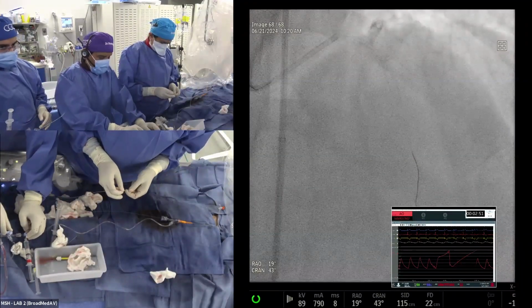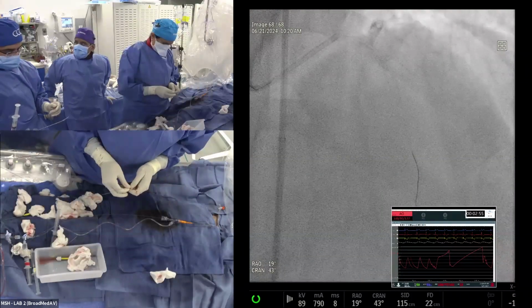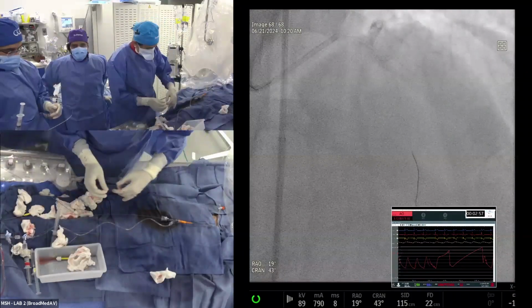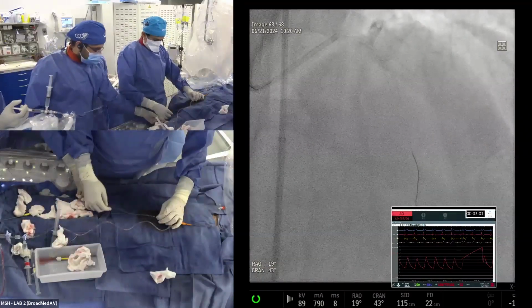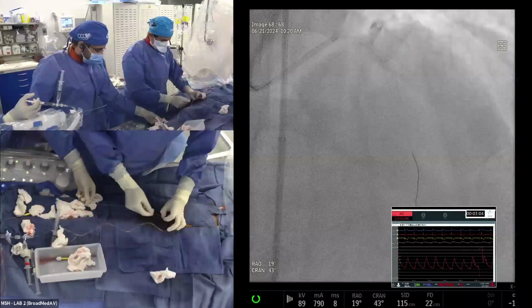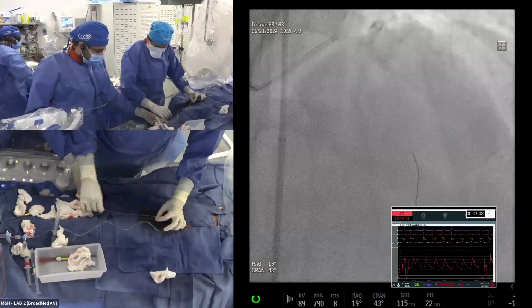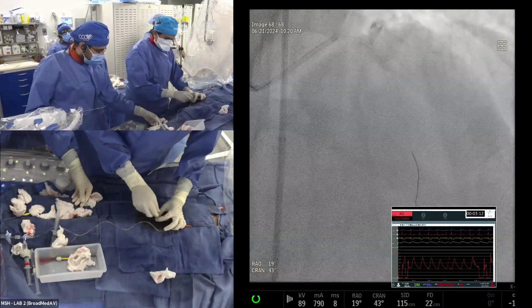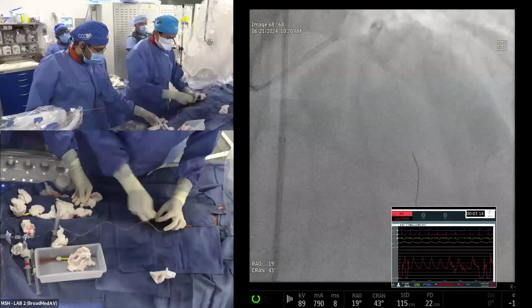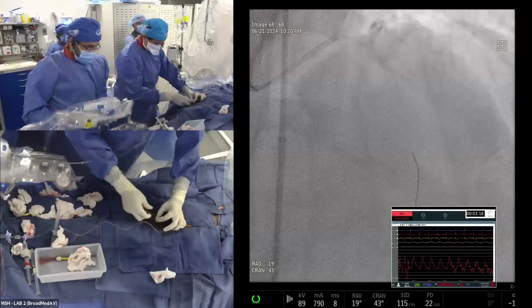Everybody is different in our lab, but I do post-dilatation in only 60-70%. The remaining 30-odd percent have no post-dilatation, because everything looks quite good. In a case like this we did a lot of plaque modification. We have done the cutting balloon, we have done the high pressure, and after rotational atherectomy, it's okay to just leave it. So let's see, are we ready with the IVUS again?